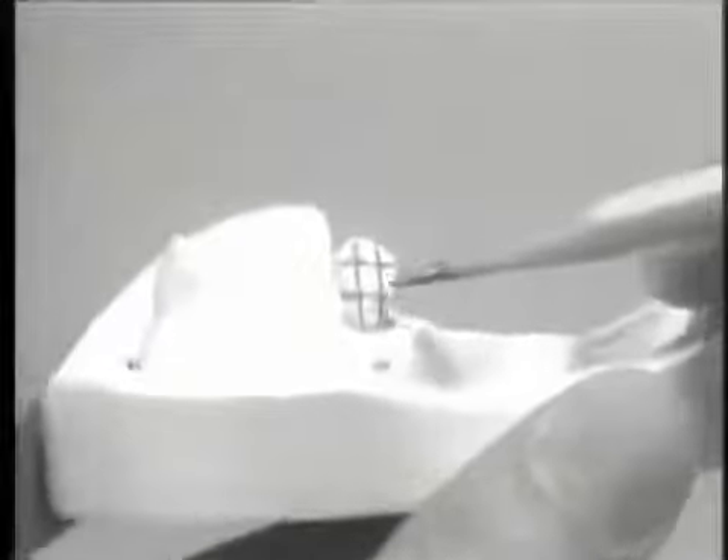The unprepared endodontically treated tooth filled with gutta percha is divided into nine segments by outlining with a number 2 lead pencil. The number 700 tapered fissured burr or a 110 SP diamond instrument is used to accomplish tooth reduction to the free gingival margin. Gross reduction of the tooth should be done in a segmental approach to reduce the risk of fracture. Attempts to quickly section the tooth at the level of the free gingival margin can result in subgingival fracture and make subsequent margin placement difficult.